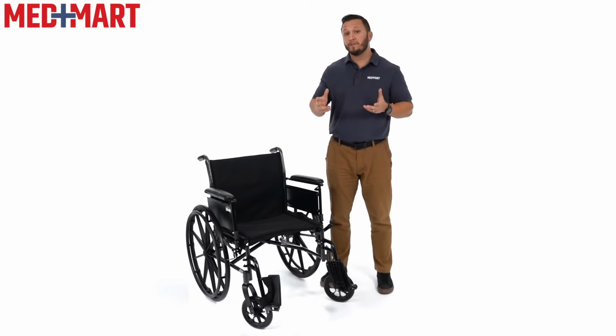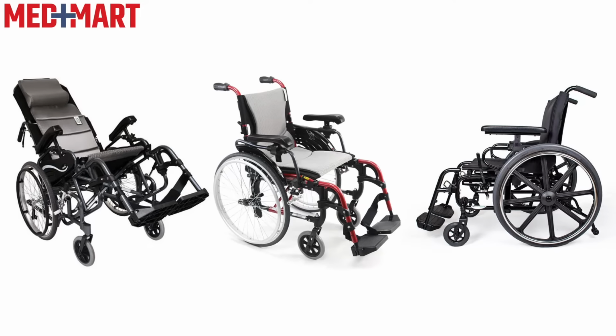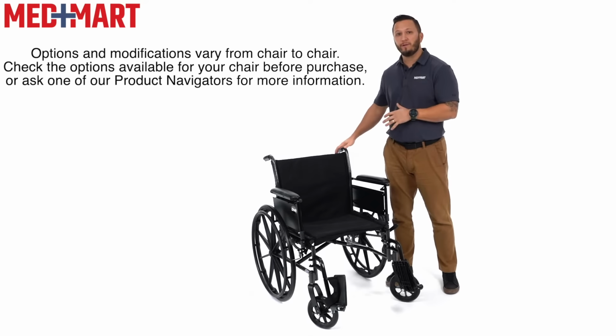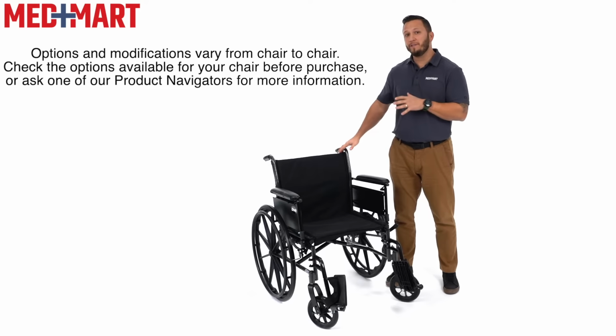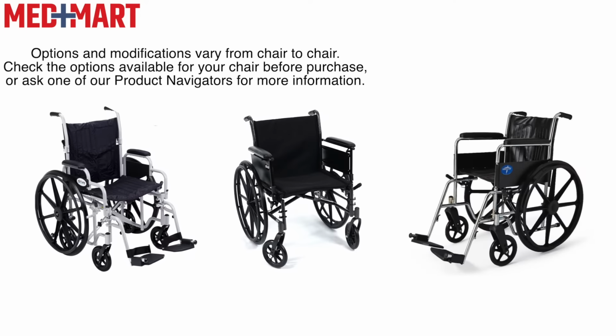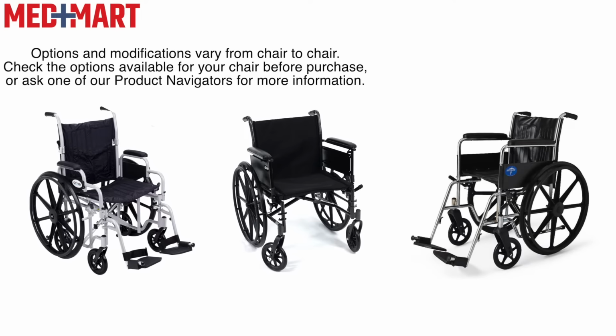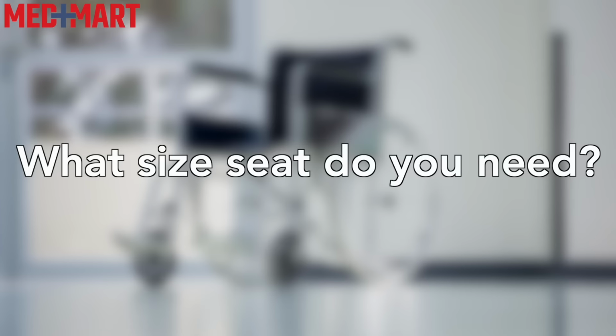There are many different classifications of wheelchairs. Some of them are very complex and highly modifiable. Others, like this standard manual wheelchair, can still be modified to fit you appropriately and do come in different sizes and may be more suitable for somebody that is just getting into needing a wheelchair. The first thing that you want to start to look at when it comes to deciding what type of standard manual chair you want to get is the size.